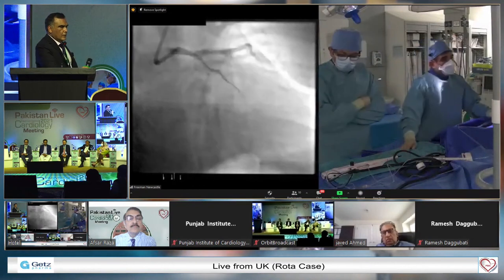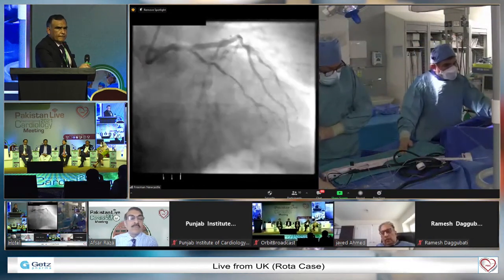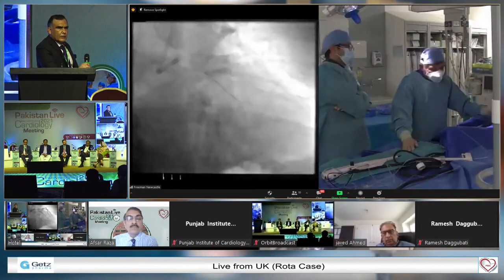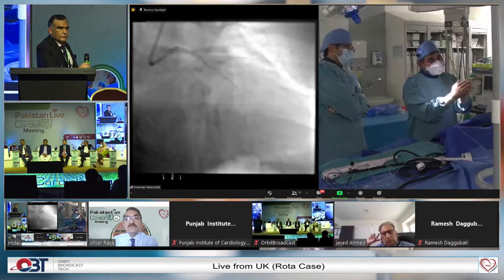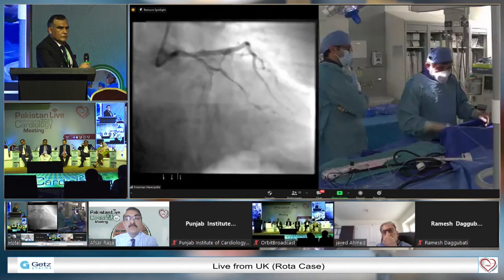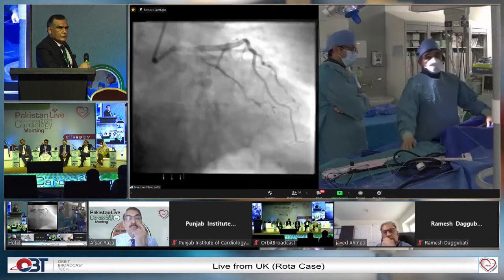It is actually 90 degrees. If you see it in this view, there's a lot of overlap. You took a few angiograms, and the cranial view is the one that shows you this best. And I think the reverse T, because you have the stent in the left main, you could see it on the angiogram and see where to put your stent in the ostium, so you know you've covered the whole thing. But DK crush is not a very good option, too, because it will not accommodate the size discrepancy.